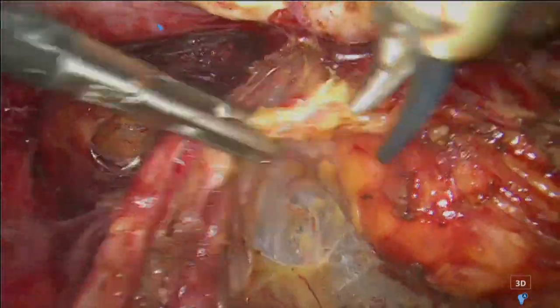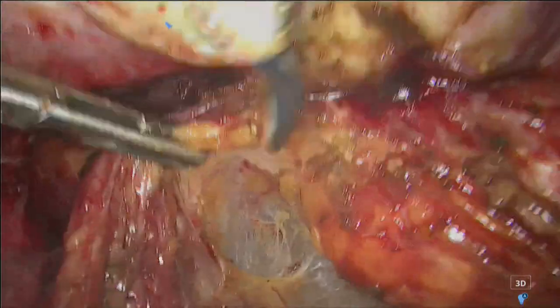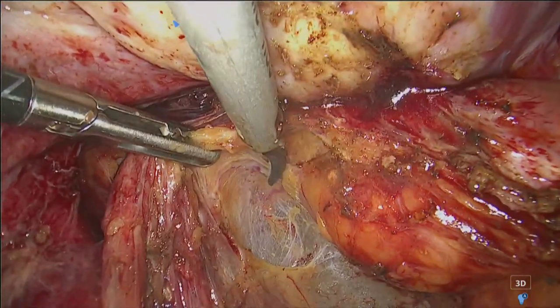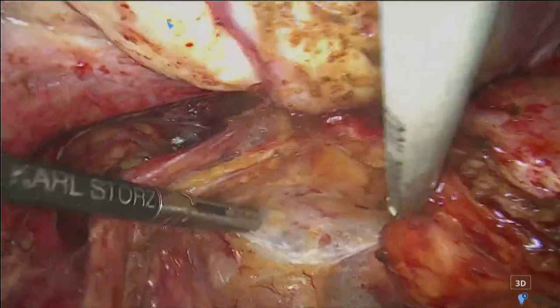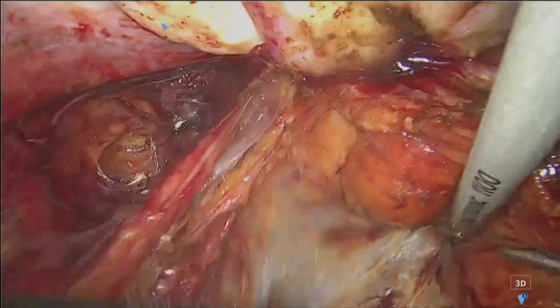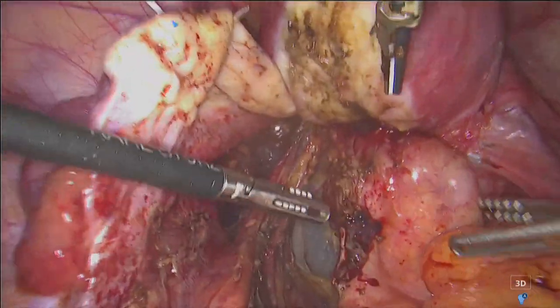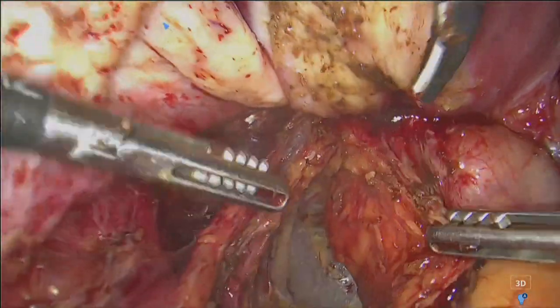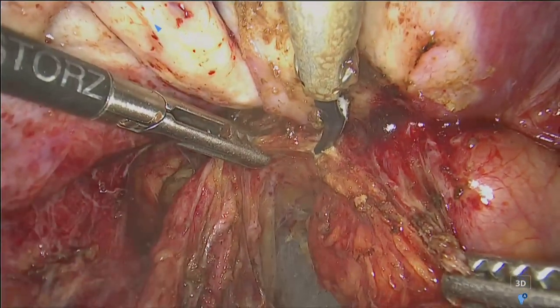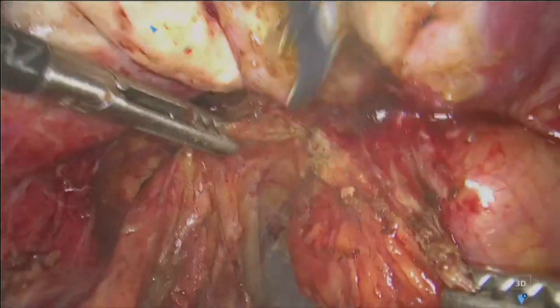So this preparation in this case is very educational, very good for anatomy. The first question is about the use of bipolar. I was using the biclamp before. Now we are using the harmonic instruments, ultrasound instruments. But the bipolar biclamp setting is no more than 20.